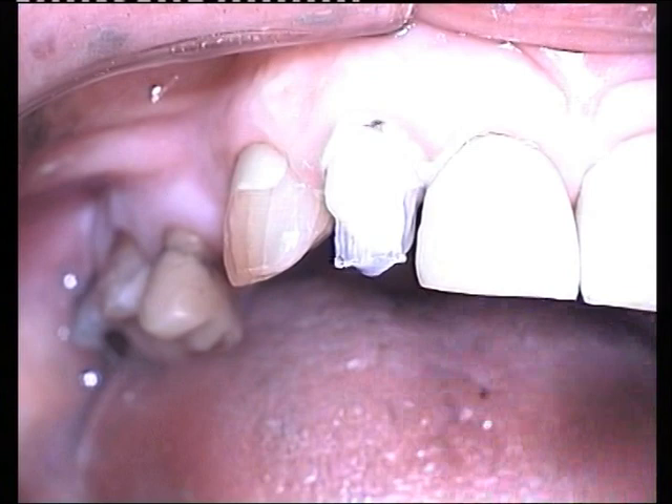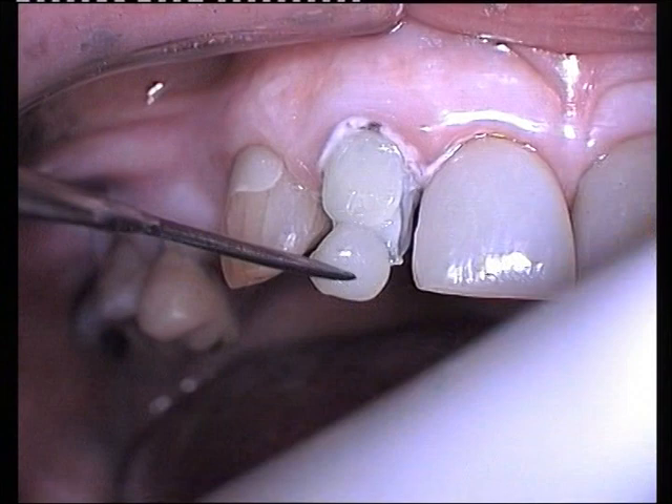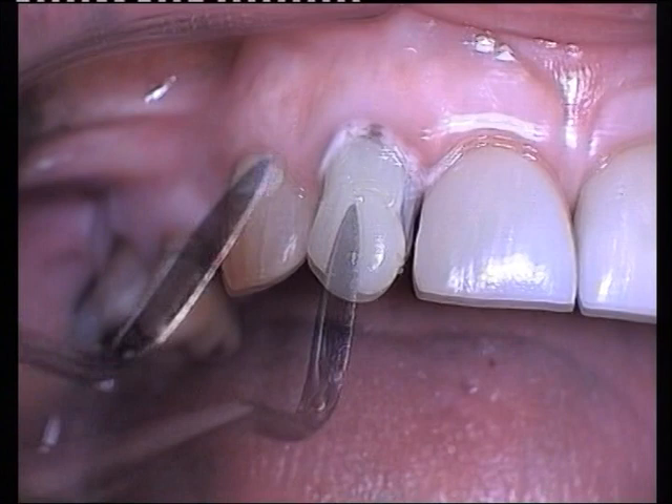The surface is then re-coated with resin. A micro-fill resin of body shade is puddled onto the labial surface to the incisal margin using a wards carver. Before curing, a small increment of white tint is placed on the surface and characterised into the resin.